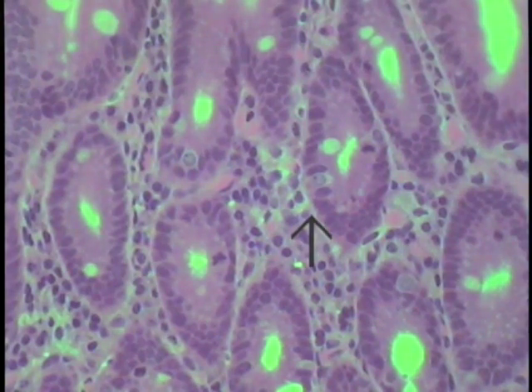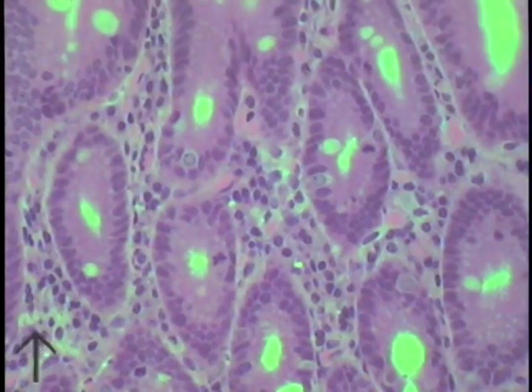This is a small region of the duodenal mucosa, but down in the region of the crypts of Lieberkuhn, or the intestinal glands, showing not only the lamina propria, and even at this intermediate objective, one can make out that the majority of these cells in the lamina propria are plasma cells, or immunocompetent type of cells. This is the intestinal epithelium of one crypt, another one shown here. Here's a mitotic figure, another one shown here as we observed earlier. So this is normal intestinal epithelium.